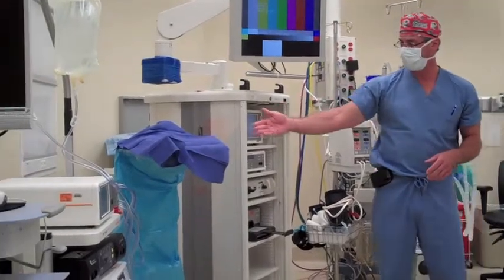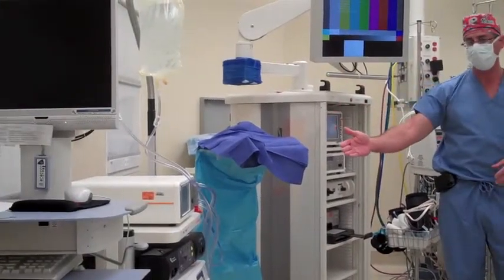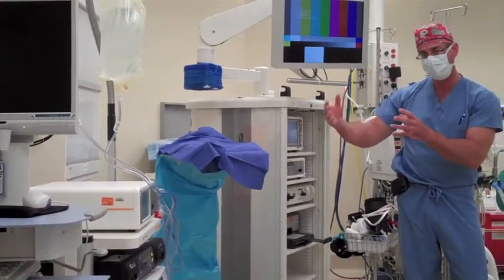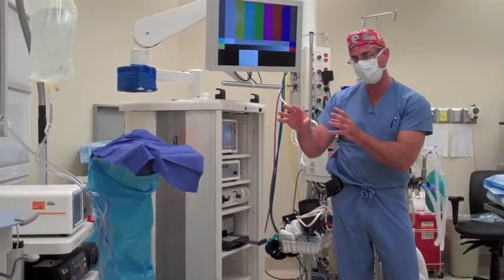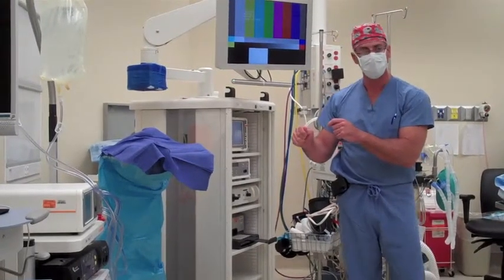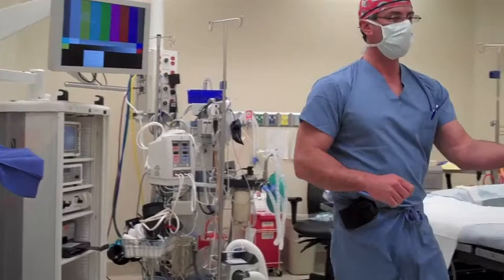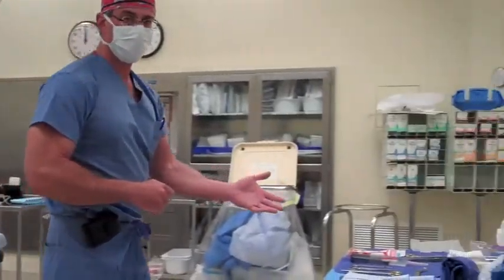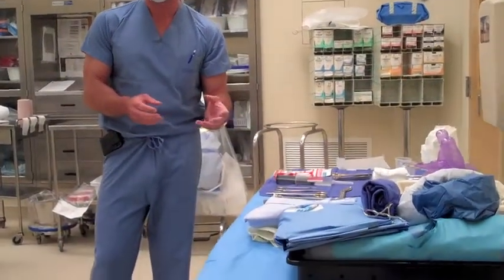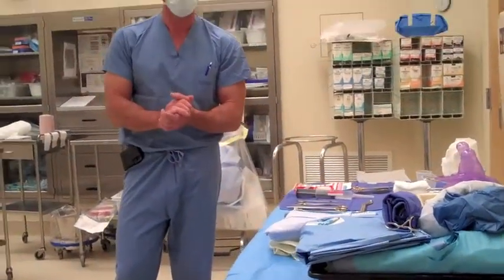This is the setup over here for where the fluid is going to be pumped into the knee. As a general rule, what we like to do is have a fluid medium so we're able to see very clearly into the joint, and that way not create a lot of injury to the cartilage on the inside of the knee. And then over here is just the basic instrumentation that we utilize. And once the patient's brought in, we're going to give you a little live action shot of what it looks like, visualizing everything as we're doing it live.